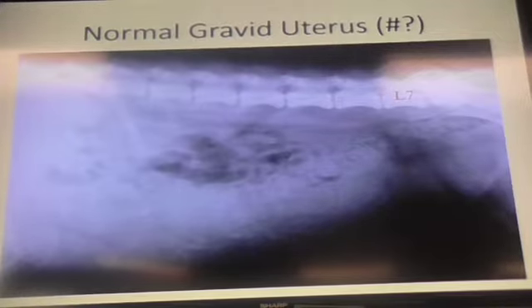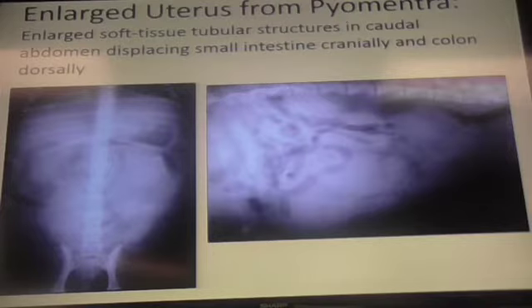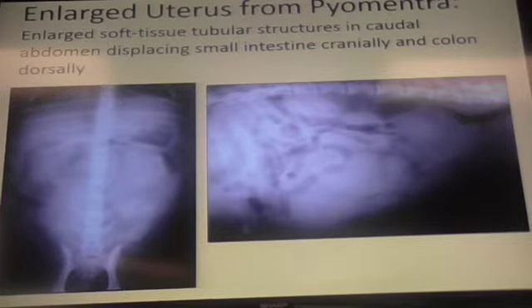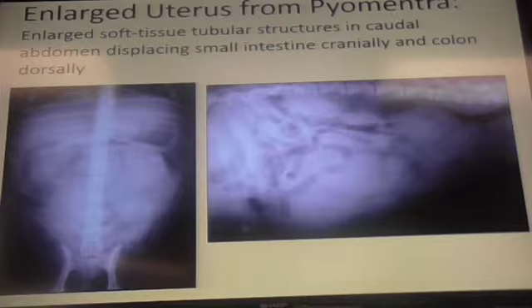If you want to know if the dog is pregnant on ultrasound, we usually do something like 25 days. For those of us who can do ultrasound and pick up the gestational sacs, we can pick them up as early as 18 days post last breeding. But for you as clinicians, I would say somewhere between about 25 and 30 days, because you're going to see them.